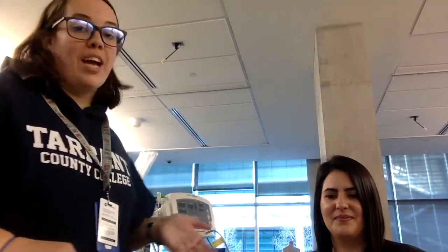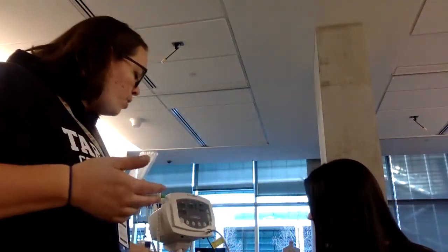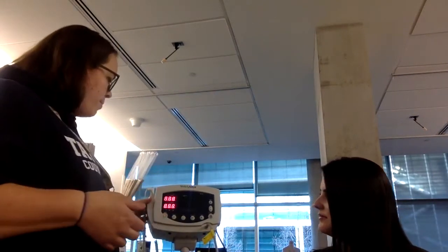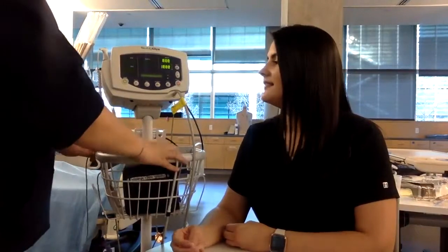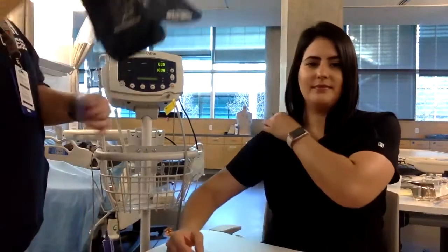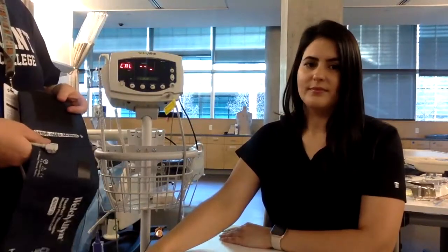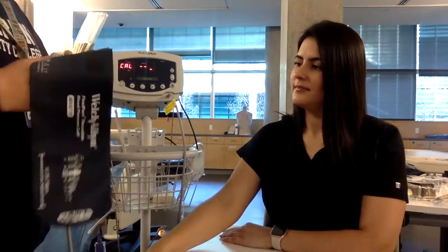I'm going to check Ms. B's vital signs and show you the general procedure. Keep in mind your instructor may have different preferences. I've turned my machine on, and I always like to start by attaching the blood pressure cuff first because it takes time. At most hospitals they may have their own blood pressure cuff in the room — you don't want to be going room to room using the same cuff and spreading germs.